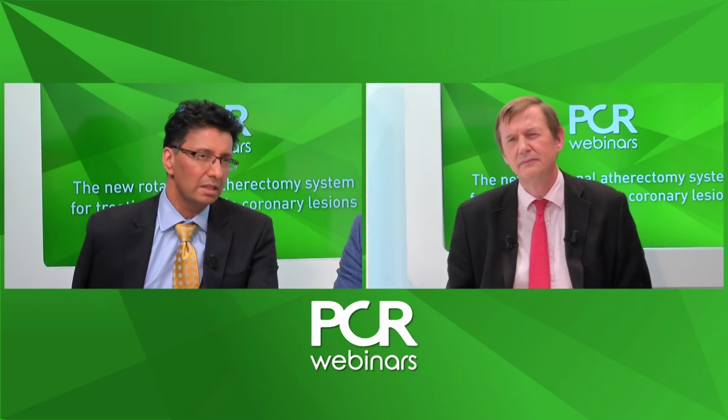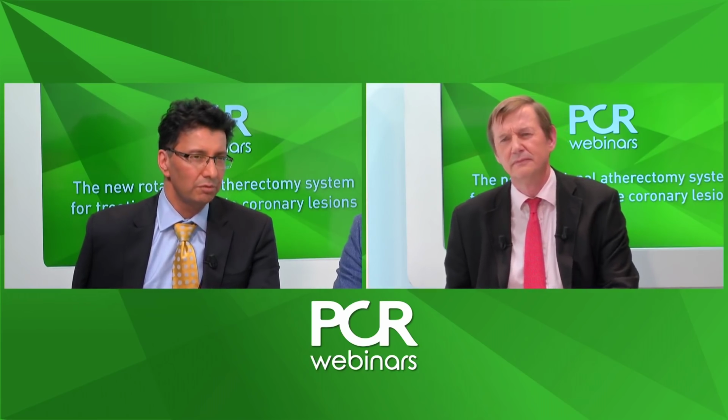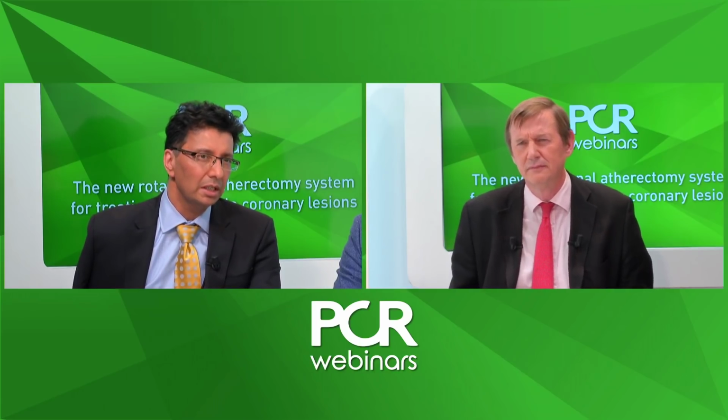Well, certainly in addition to the undilatable lesion, which is effectively a class 1 indication, I think it's entirely reasonable to also use rotational atherectomy in a heavily calcified vessel which you haven't actually approached yet with a balloon, with the purpose of improving balloon and stent delivery and facilitating stent expansion to reduce the risk of restenosis and stent thrombosis. Bruno, do you have any other comments to make about the use of this tool?